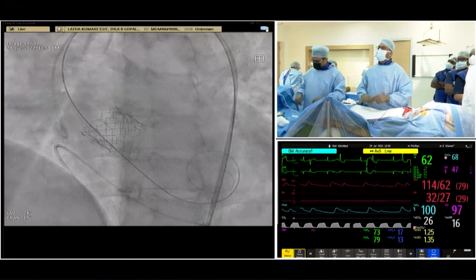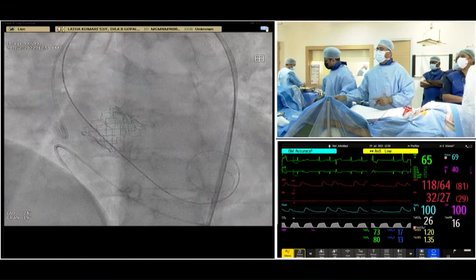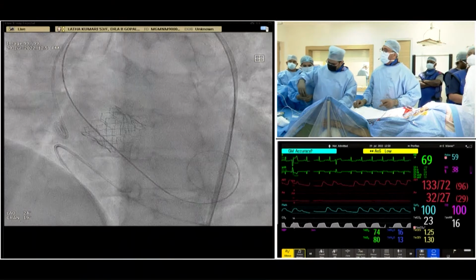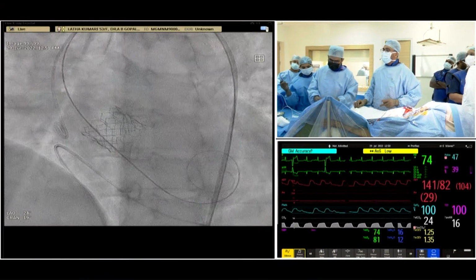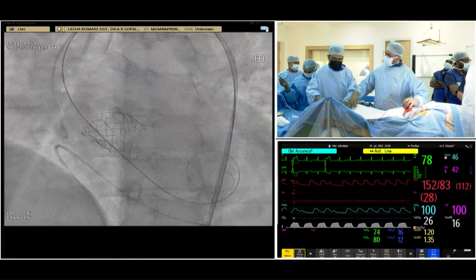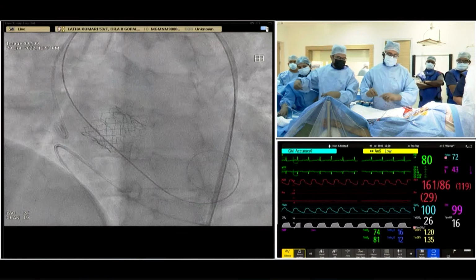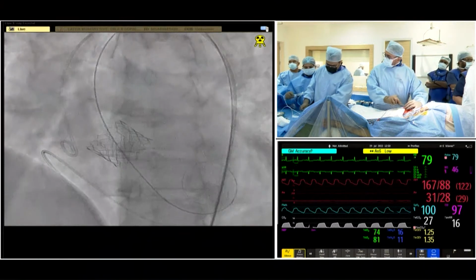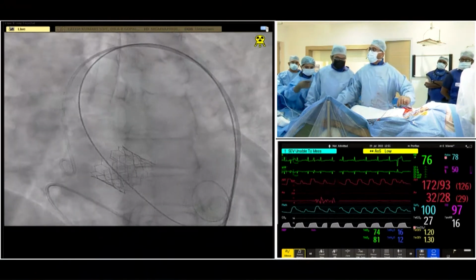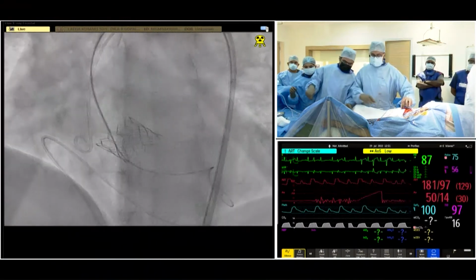Pigtail, please. So the aim was to get zone 0 or +1, that's it, not more. So I aimed for a very high implant. So let's see where we get to. The pressures have come back. The diastolic is 74. So let's put a pigtail, guys. Ready for 2 pressure lines. So the intention was to get a high implant, if possible zone 0, and that's to avoid a pacemaker. So let's see. We have intrinsic rhythm. The PR interval looks normal. There is no conduction abnormality that I could see. Hold on a second.